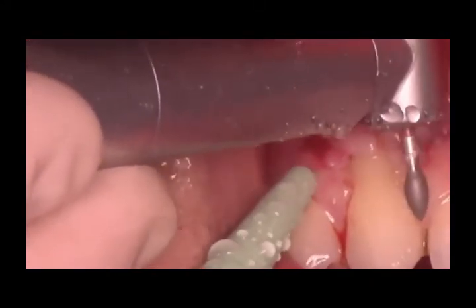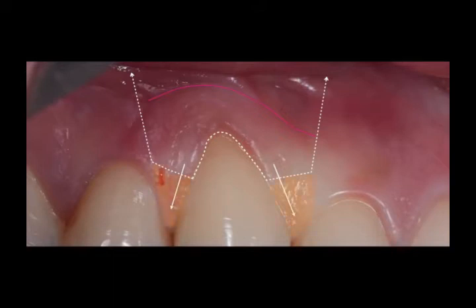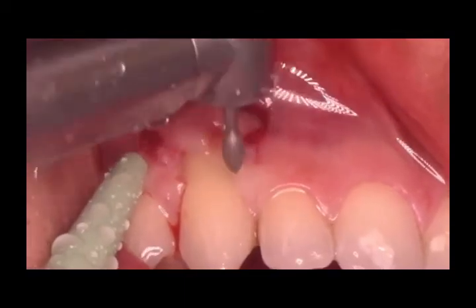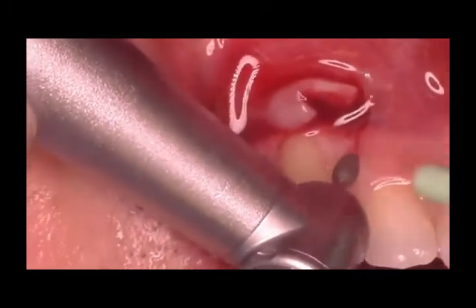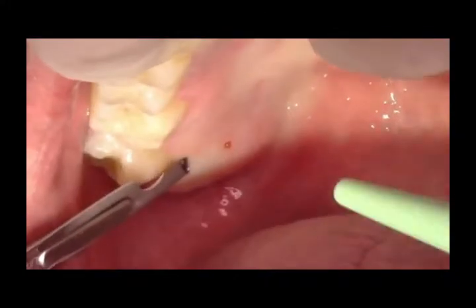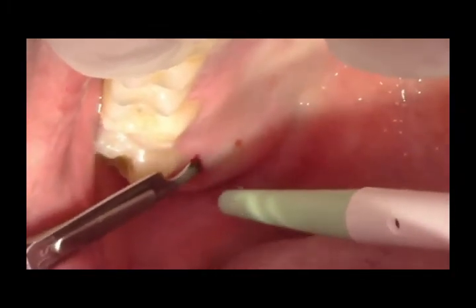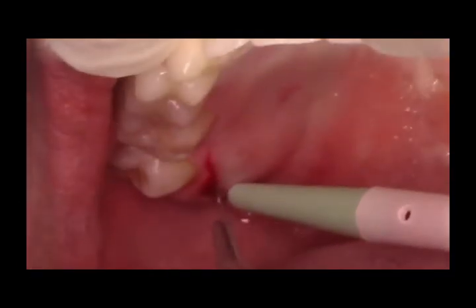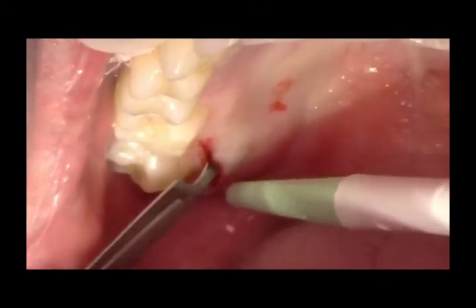The flap is then de-epithelialized with the help of a carbide burr, and the flap margins are trimmed. The connective tissue graft is procured from the palatal area of the maxillary arch. This connective tissue graft is considered the gold standard procedure.